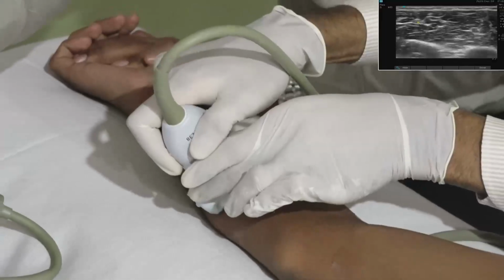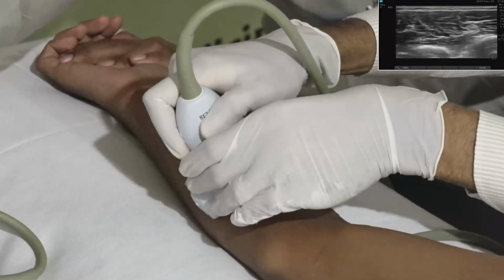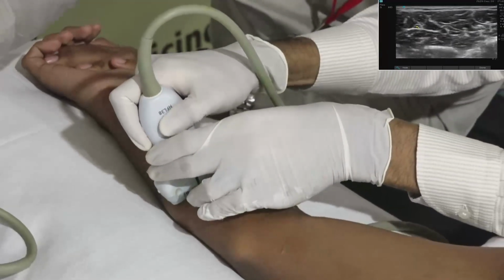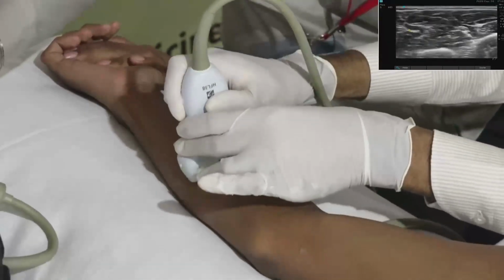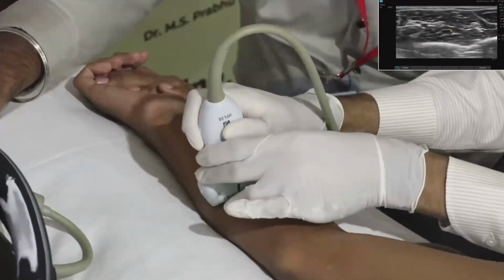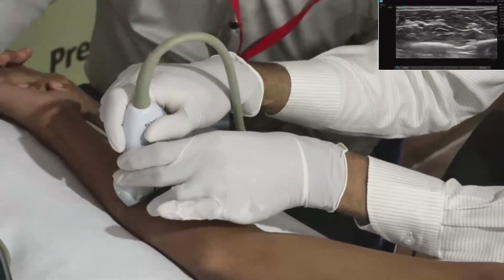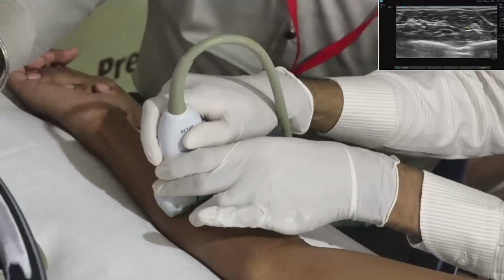So I'll get the panoramic view. That panoramic view is for both median and ulnar. So what is this panoramic view? You can see three important structures and two important muscles. The muscle component, like we know, is between flexor digitorum superficialis and flexor digitorum profundus. Flexor digitorum profundus is a bigger muscle. It covers both. It is lying anterior to, posterior to both the ulnar nerve and median nerve.